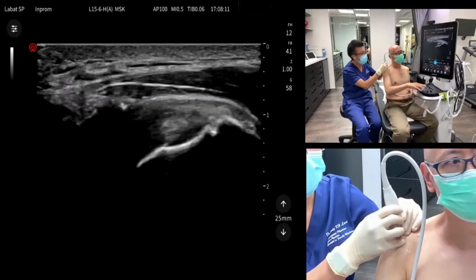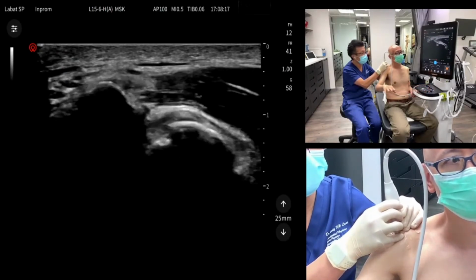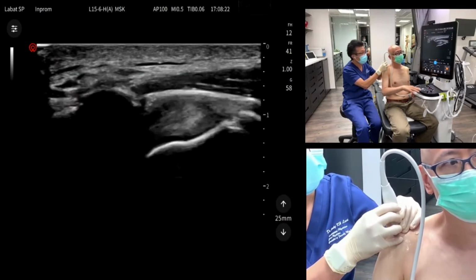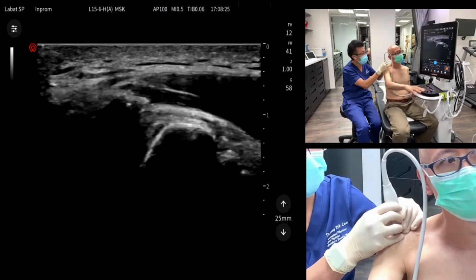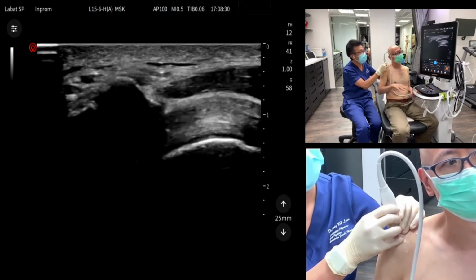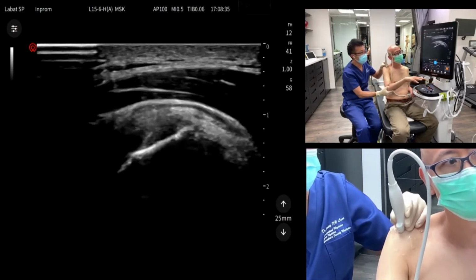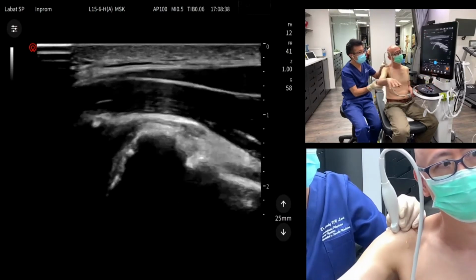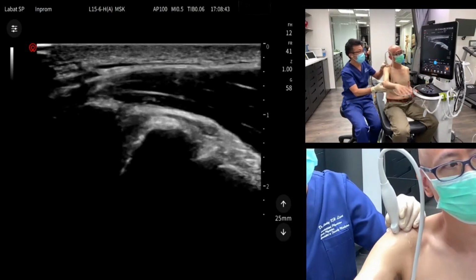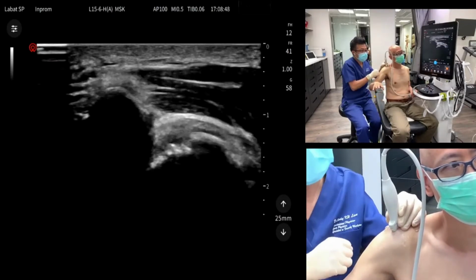Especially if you're starting to feel pain because your acromion is having a lot of friction between the humeral head and the acromion. So right now, you have this stiffness feeling and also pain at the same time. So that's when the patient presents with a lot of discomfort. So you demonstrate to the patient that you're going to do this and then back, and then you're trying to see the friction. And in fact, you can see Robin when he's doing this, almost to this extreme.